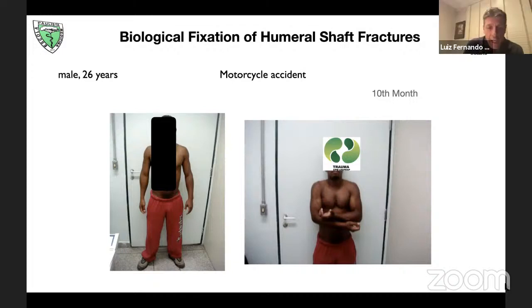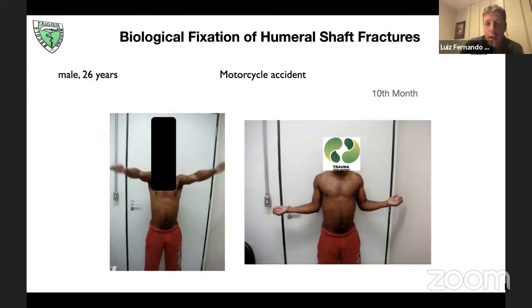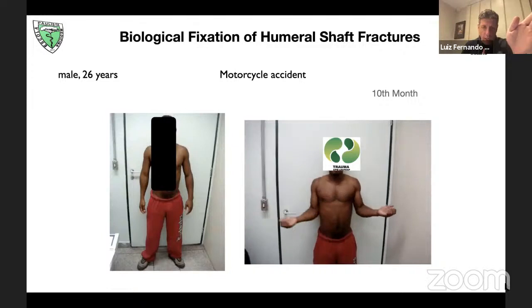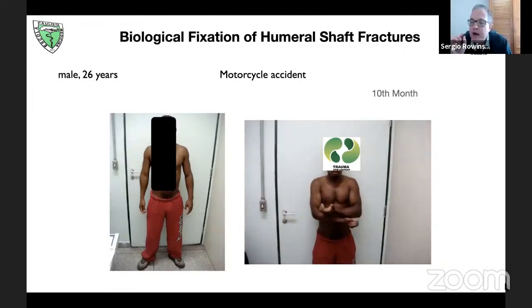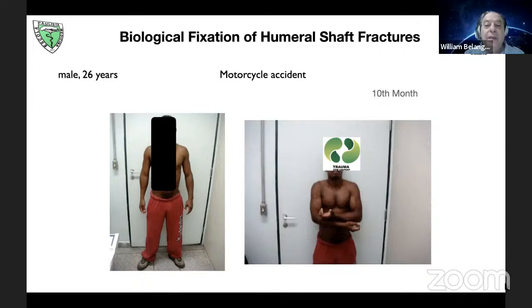To finish the internal rotation, the patient has to put the shoulder a little bit forward. In my mind, what happened here, probably we fixed in the right axial alignment, but a little bit of rotation. Right? I think the distal aspect of the humerus is not exactly easy to identify. Yeah, right, Coco, but it's working. In the posterior approach, it's not easy to control or to identify rotational deviation. It's not easy.